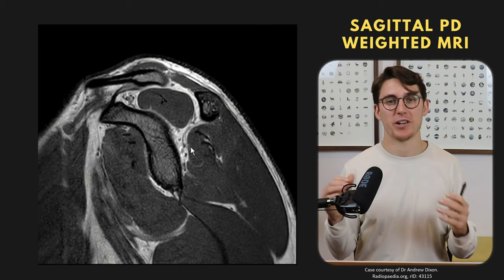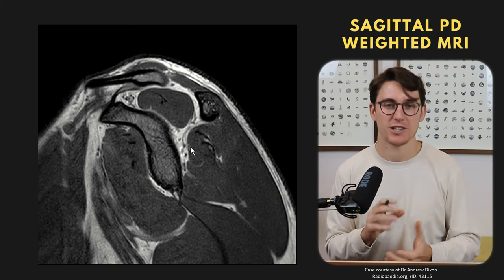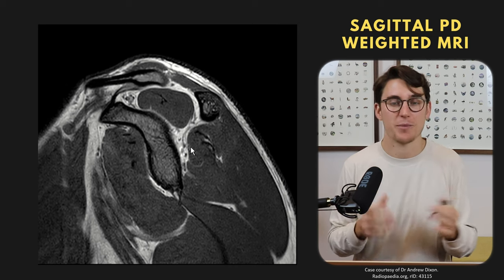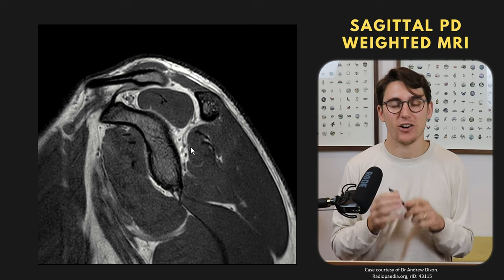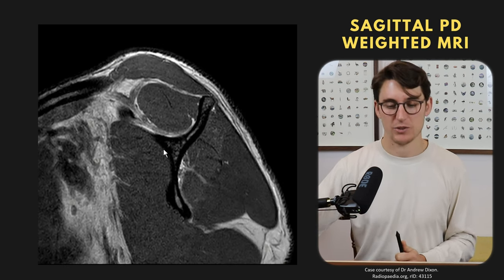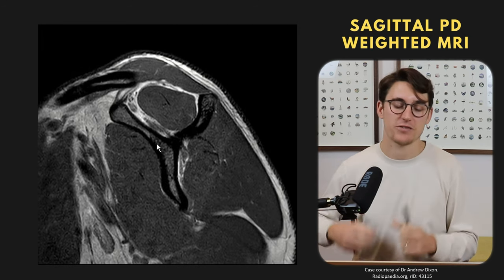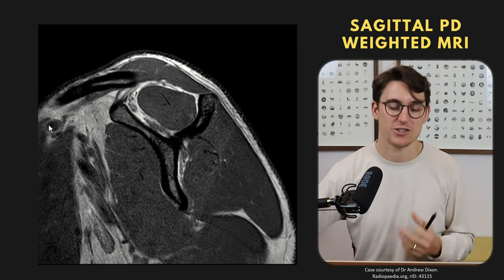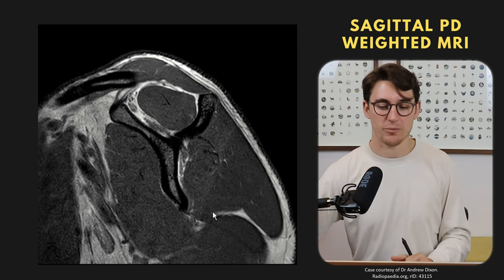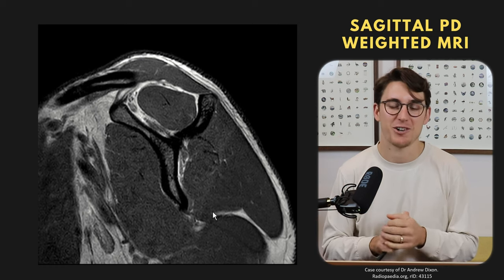To summarize the approach to shoulder MRI: look at the bones, then the ligaments, then the labrum and capsule, then the muscles — going through each systematically. This ensures you don't miss obvious abnormalities. Knowing what's normal is arguably more important than knowing what's abnormal. We've been looking at PD images where fluid and fat are both bright. If you want to differentiate between fluid and fat in a space, fat-saturated images can be used — though the fat here gives nice clear muscle boundaries, making anatomy easier to identify.